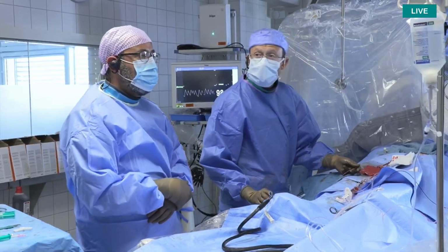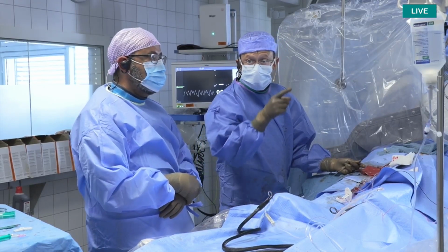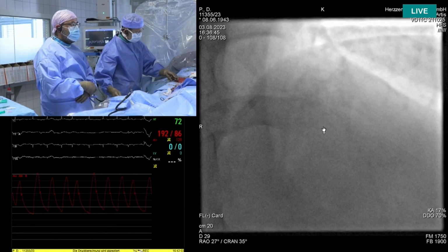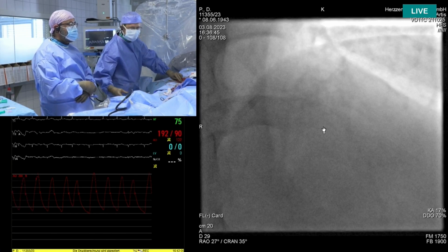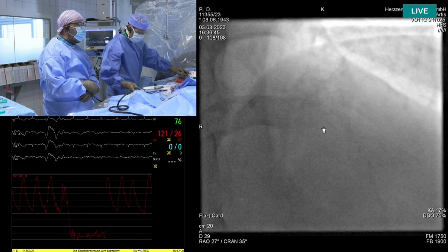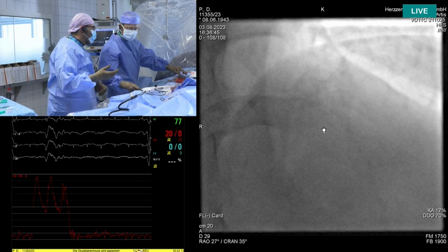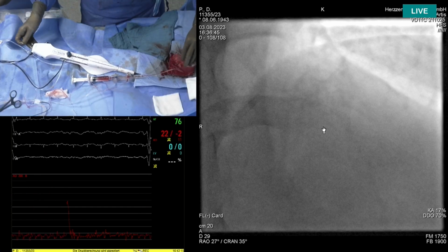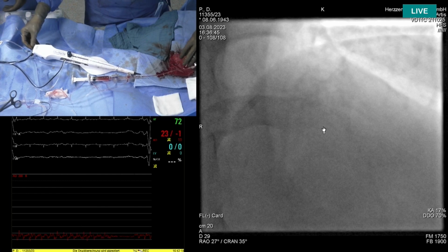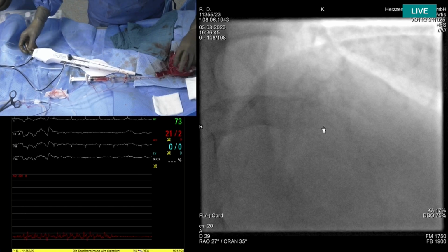But on the other hand, we are currently treating patients with a lot of calcification, calcified nodules, big vessels, left mains, and in these patients, even if you start with a small burr, as you can see here, sometimes you don't ablate enough in order to modify the lesion. And this is why I would say in Dimitri's practice, he would be using maybe 2 burrs in 10%? 25. No? No. Okay. So you stick to the data, which is good.